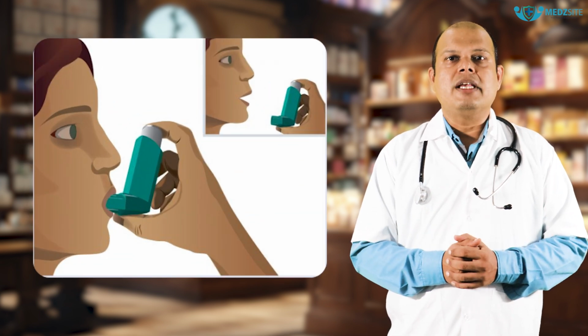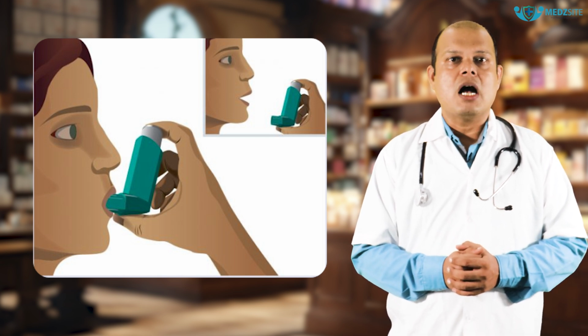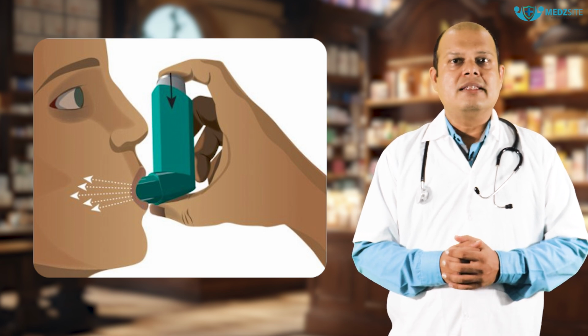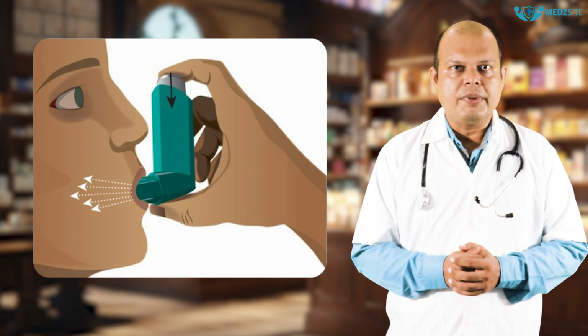Place the mouthpiece in your mouth between your teeth and ensure your lips are completely closed. Press the top of the inhaler and at the same time breathe in slowly and deeply through the mouthpiece. Hold your breath for 10 seconds. This will complete your puff. If more than 1 puff is suggested by the health provider, repeat the whole process. But make sure you keep at least 1 minute gap between 2 puffs.